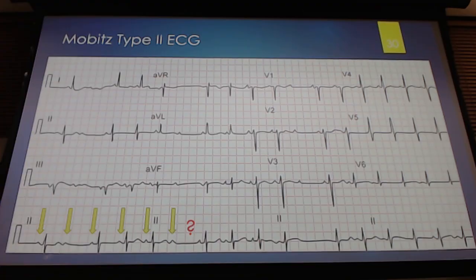But they're pretty rare. We got P, QRS, T, and we've got something here, okay, and then we have a P wave here. Well, can I figure that out by marching these out? Because if my PR interval is the same, my P waves should march out. That's how I know that this is a P wave and not a U wave, because my P wave should be consistent. Okay, I'm just dropping QRS complexes. And that's how we know that is a P wave.